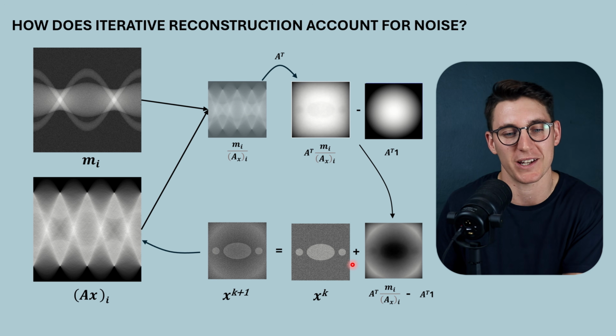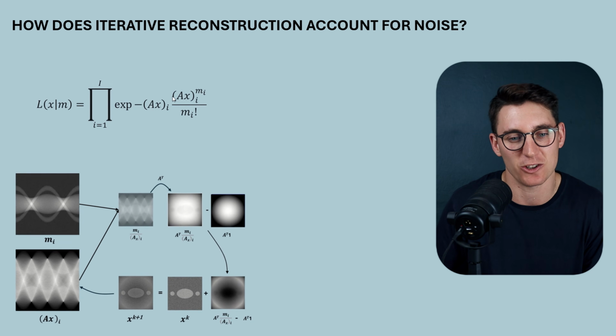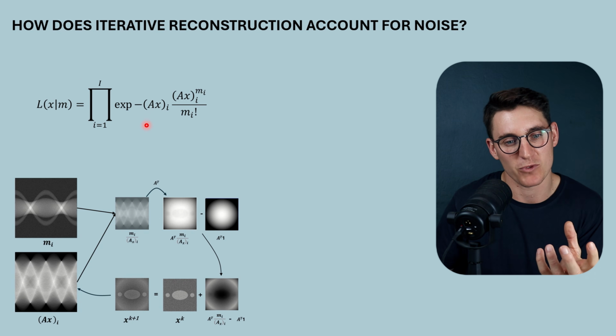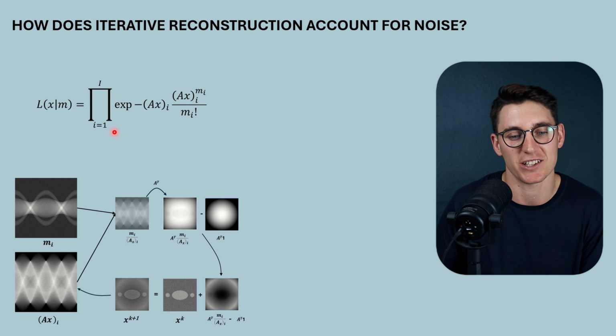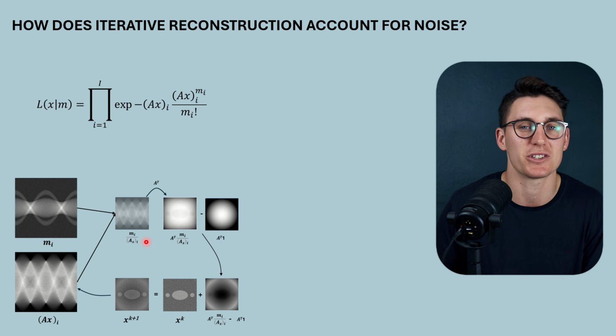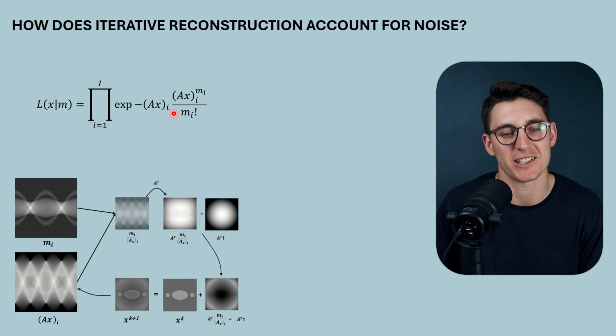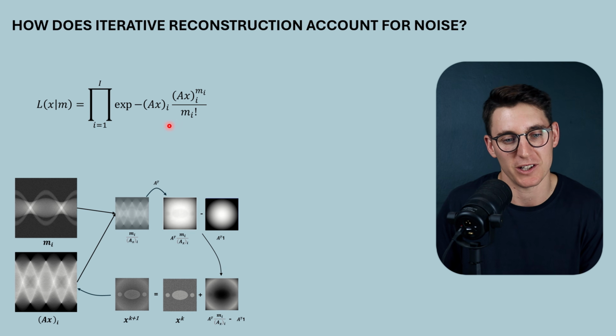And hopefully this will make sense. Don't worry if the maths gets a little bit confusing, especially if you haven't done some higher grade maths, but it's the gist that I want to get here. We're going to see the end point of this equation is going to lead to the same iterative loop that we looked at first. What we've got here is what's known as a likelihood formula. It's the Poisson likelihood formula.